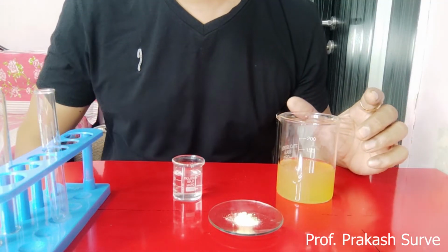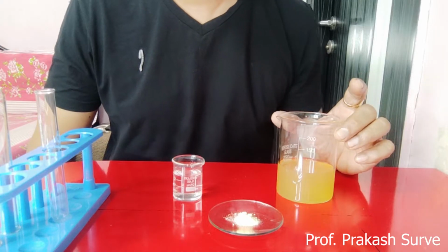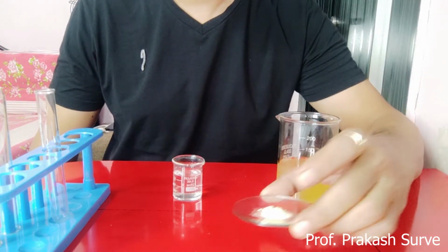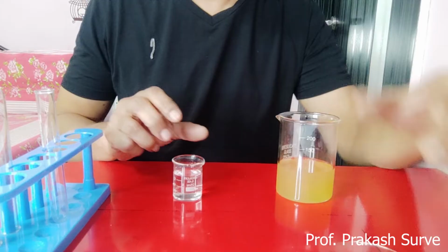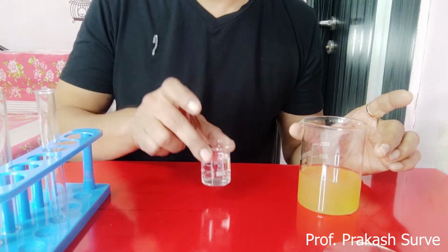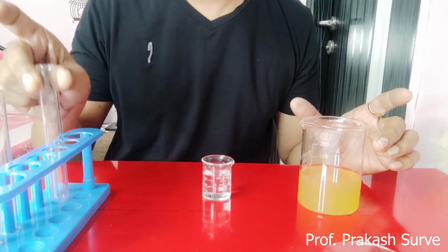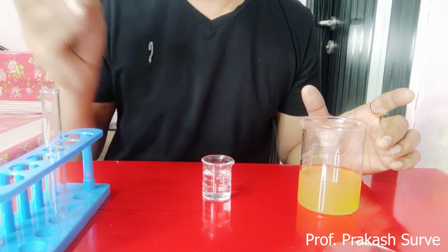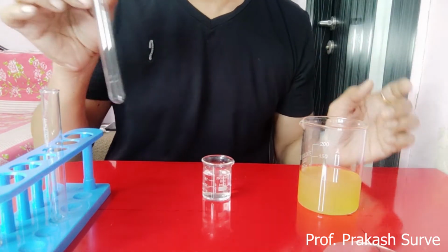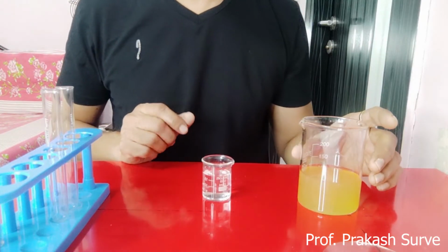The requirements for the test for bile salts, that is the Hay's sulfur powder test, are sulfur powder, the urine sample, plain water, and test tubes. So we require two test tubes. In one test tube we'll take the urine sample, and in the other test tube we'll take the plain water.